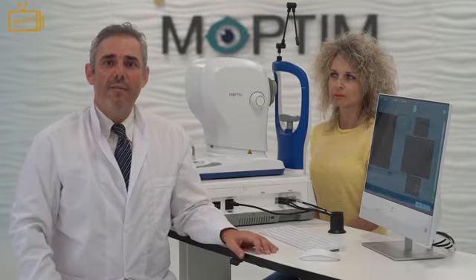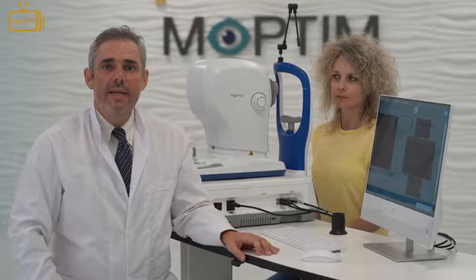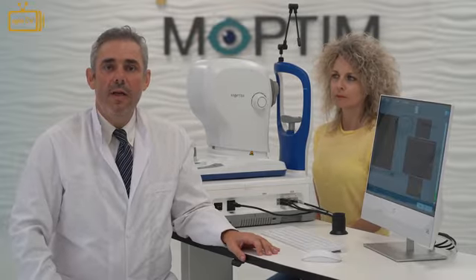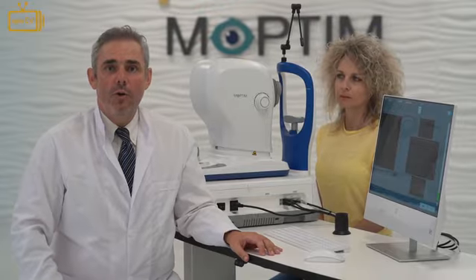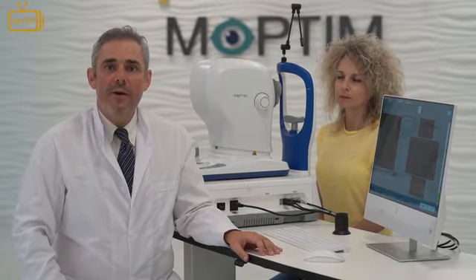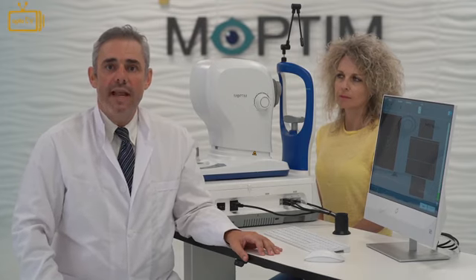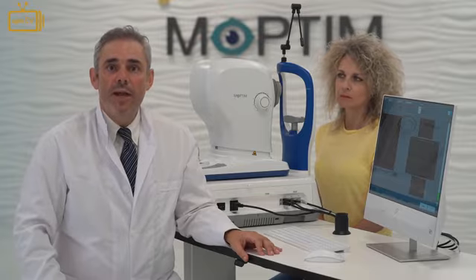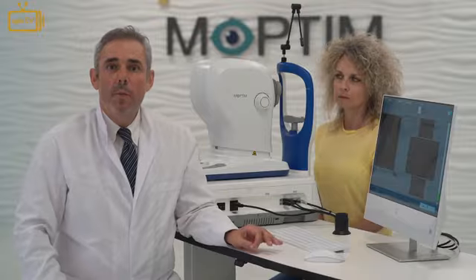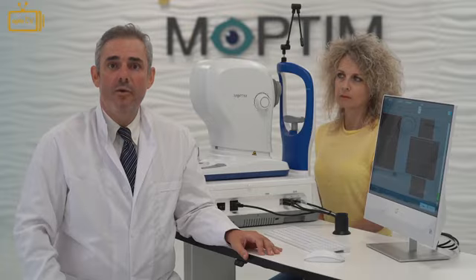Once we have finished with the macula, glaucoma, and anterior segment OCT, we will proceed with the OCT angiography. The MOCEAN 4000 uses the OMAC technology, which means optical microangiography algorithm, in order to detect 6 different layers. This is the gold standard for OCT angiography. The deeper you can penetrate with your OCT, the more accurate results you are going to have, and the better and most accurate diagnosis for your patient.